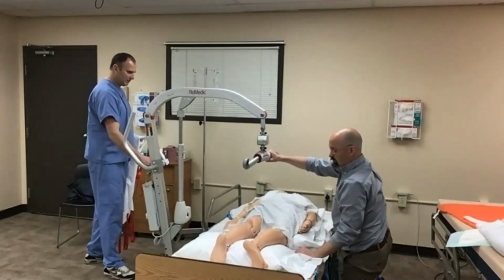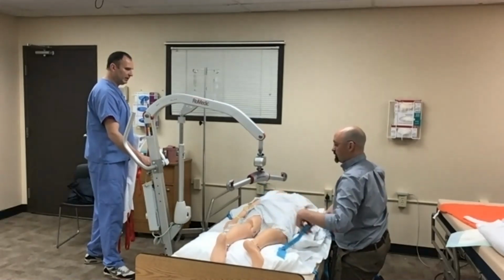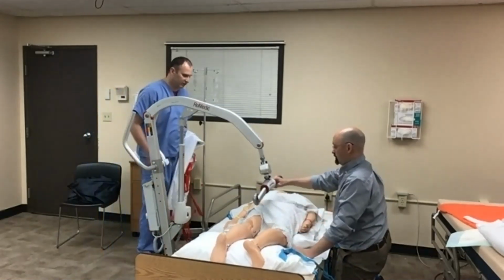A little lower? Perfect. Good. We're not going to attach the head so that we don't hyperextend the patient's neck.